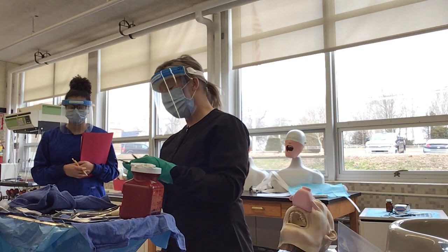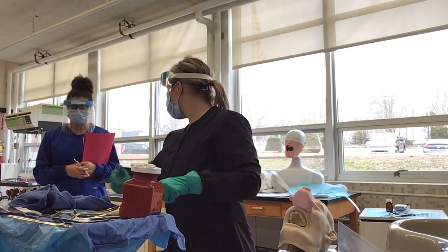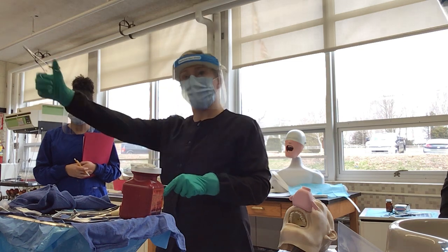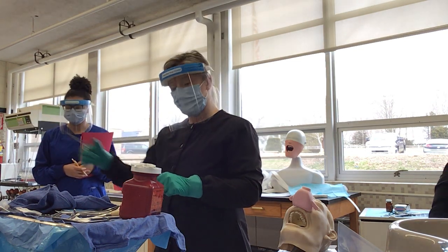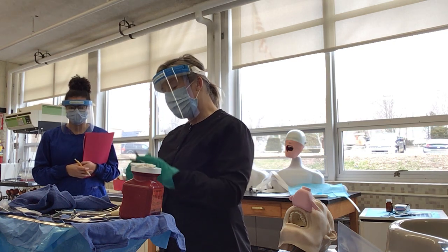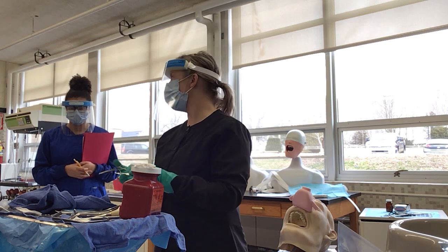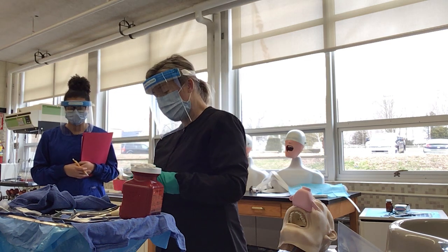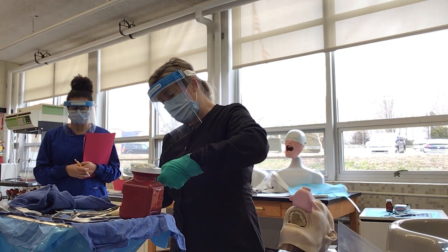When you're removing the blade, you want to make sure you're always facing it down. That way if it comes out, it doesn't go flying across the room, especially when you're practicing at the table. You don't want to send it shooting out of your classmate, okay? So when you load it, you want that angle facing you. When you take it apart and remove it, you want that angle facing down, okay? So I'm going to face down.